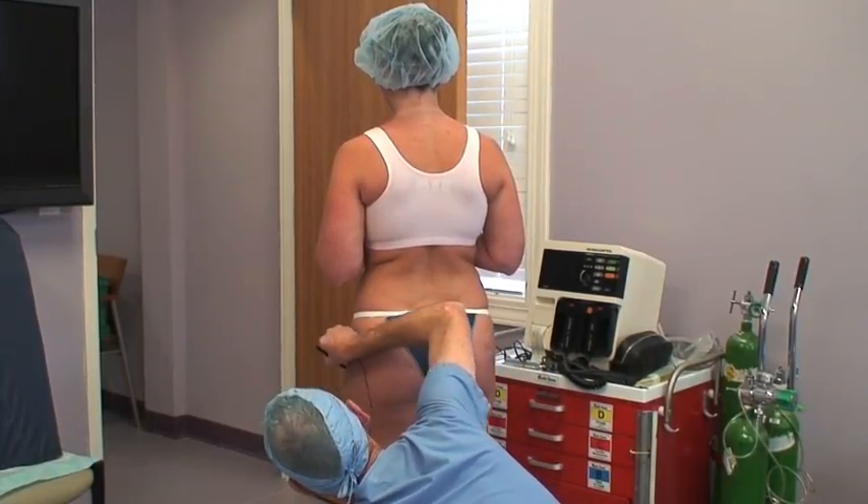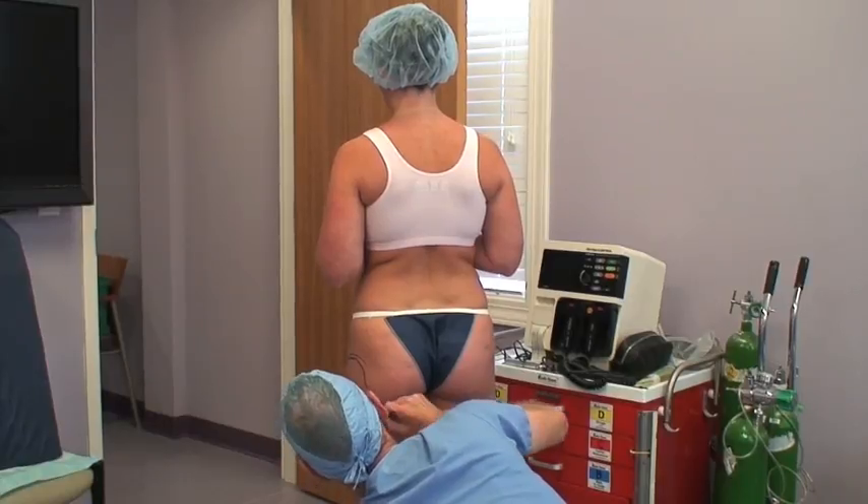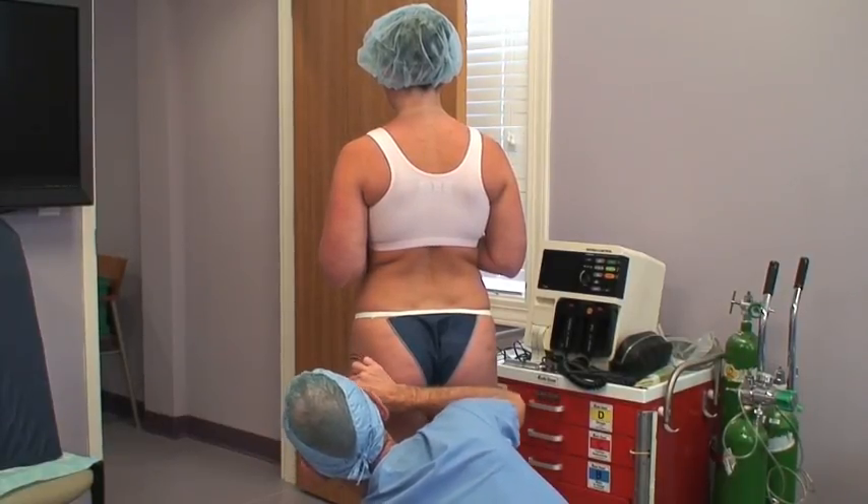We also mark it in a topographical fashion so that I know where the thickest areas of fat are, and then the thinner areas out to the edge — areas where we taper.